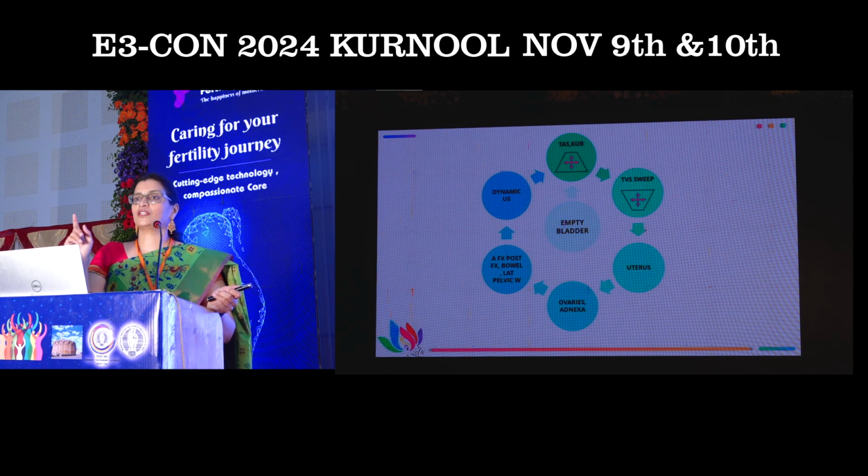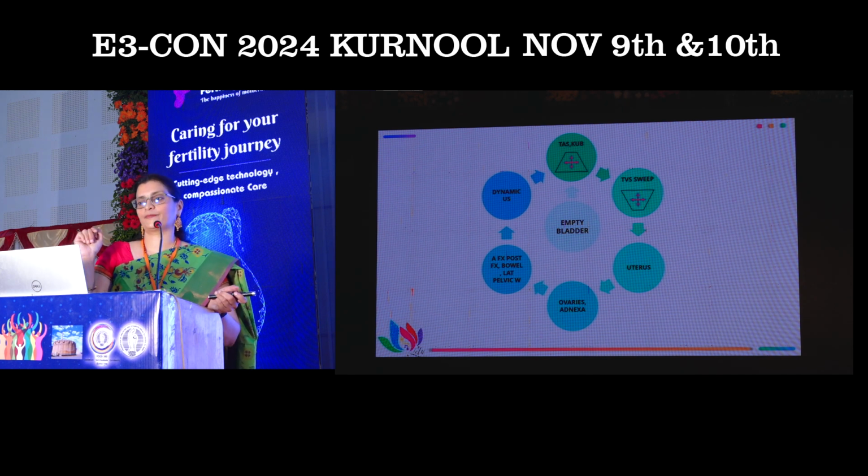So again, whenever there is a doubt, especially sometimes ovaries are placed high above and you will not get them on the transvaginal. So by the time you finish your transvaginal scan, there will be a little bit of bladder, and that window you can use for again localizing and evaluating the ovaries from the trans-abdominal approach.